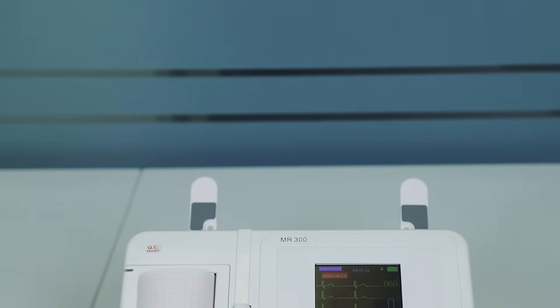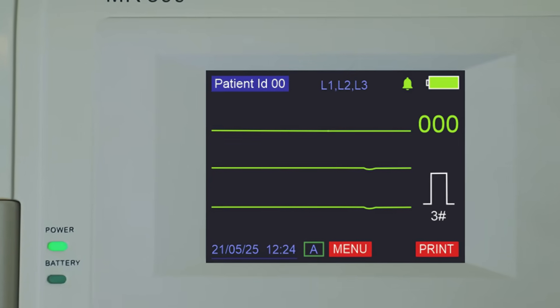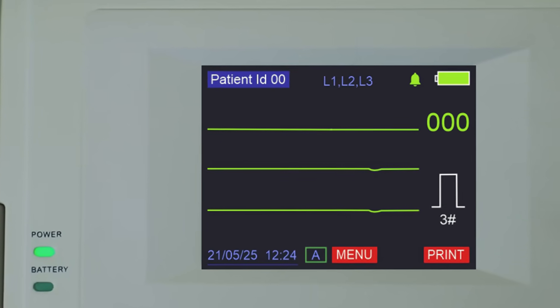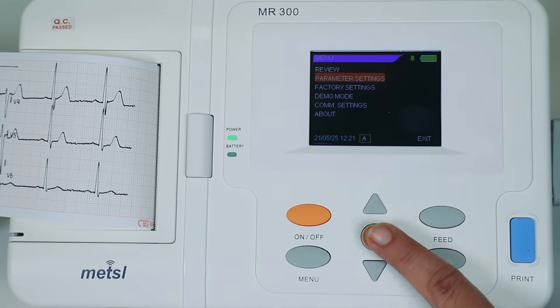Now, let's take a closer look at the device itself. Observe the crisp LCD screen, which provides clear real-time waveforms and data. Below it, you'll find the thoughtfully arranged, intuitive buttons for easy navigation and control.